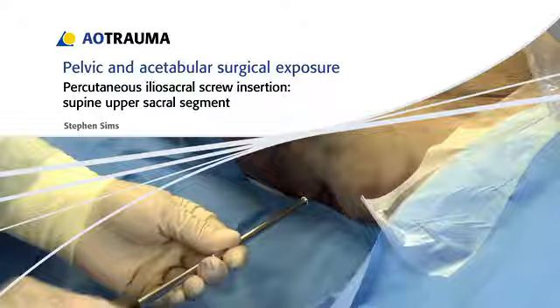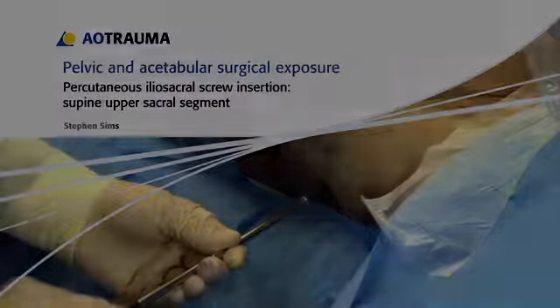The percutaneous technique is used to insert a screw into the upper sacral segment from a supine position. Prior to undertaking this procedure, the surgeon must be familiar with the anatomy and osteology of the sacrum and its upper segment.